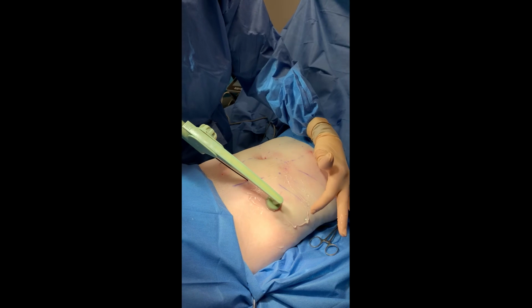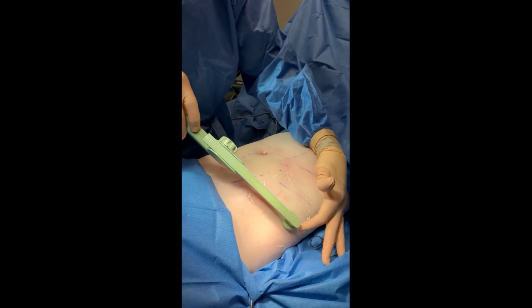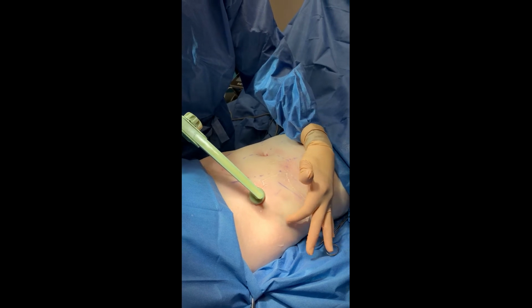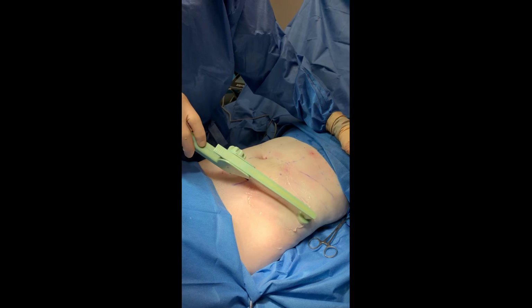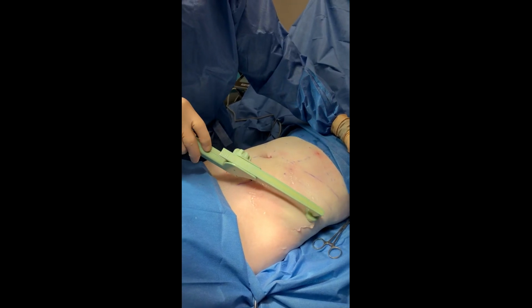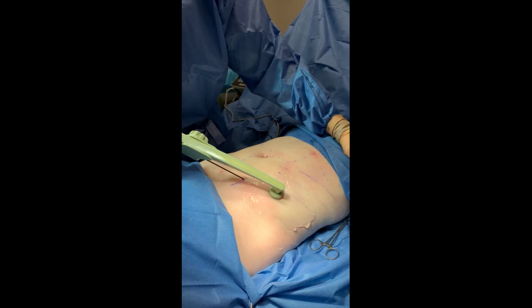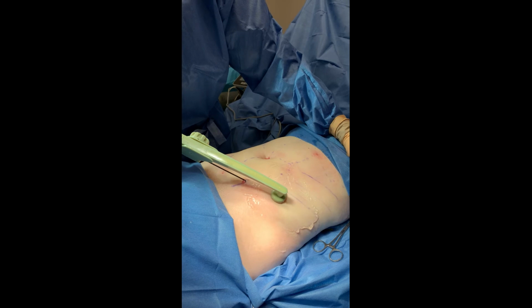And what this is registering is the amount of energy underneath the probe here, deep in the tissue. And what it's doing is emitting radio frequency energy in very controlled, precise areas and monitoring that as well.